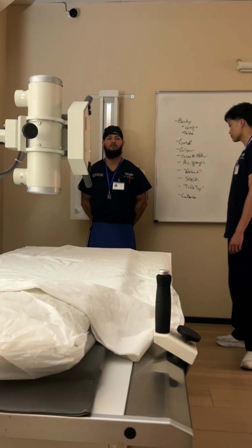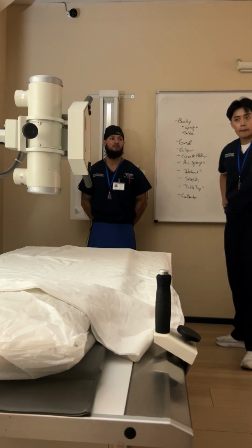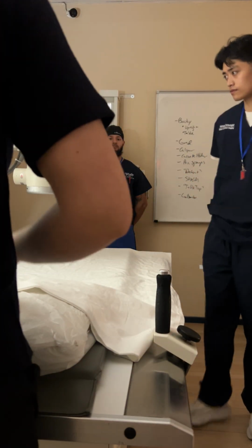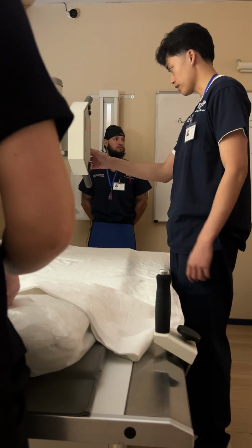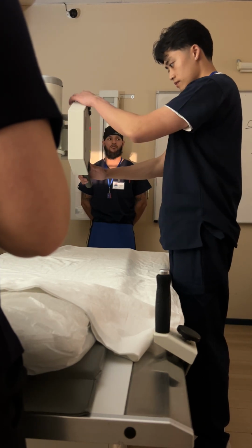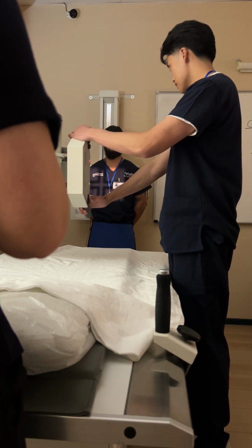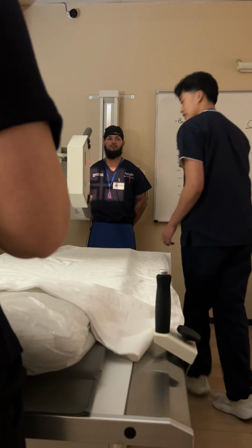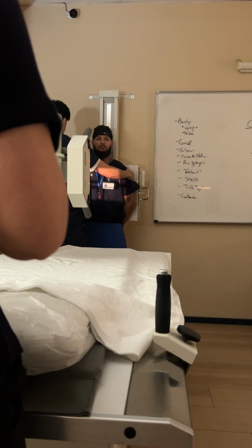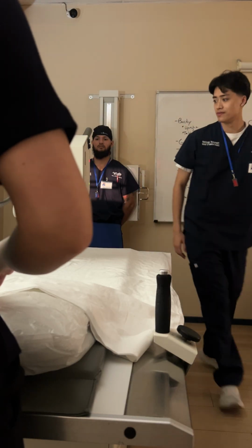Hold that. And let's check here. Hold on one second. So hop back over here. Put your chest against there for me. Okay. Put your hands on your hips for me. Roll those shoulders forward. I want you guys to get used to actually helping them roll their shoulders forward, okay? Obviously, we would not be doing this on a 10 by 12. I do think, though, maybe just a little higher, okay?